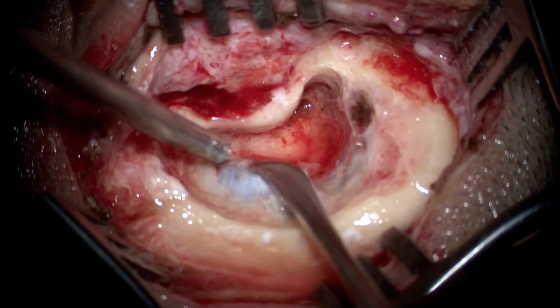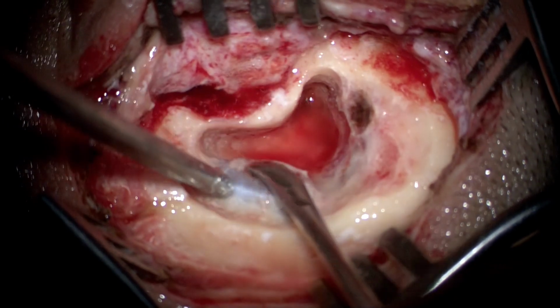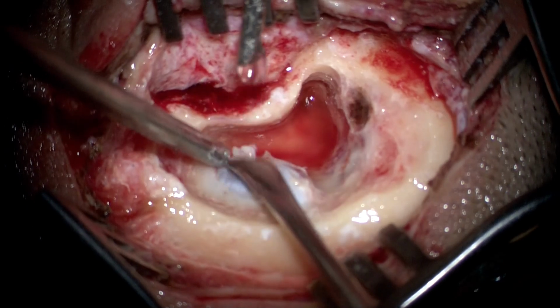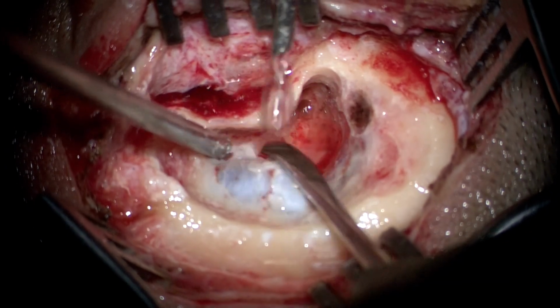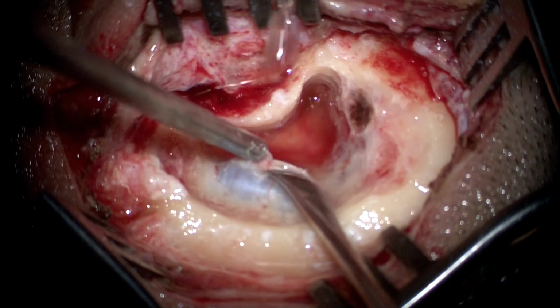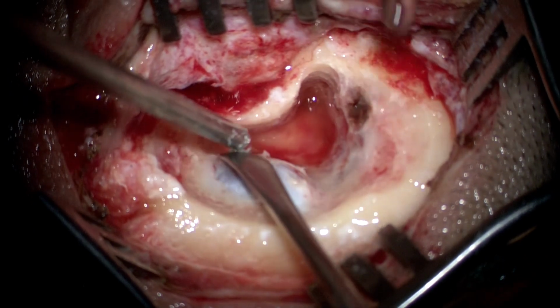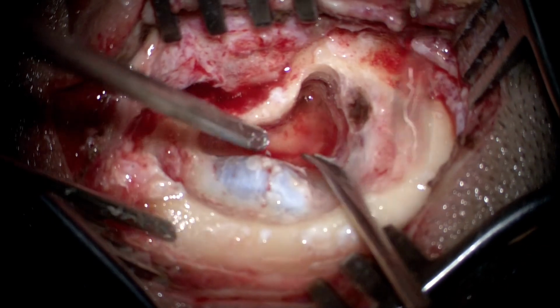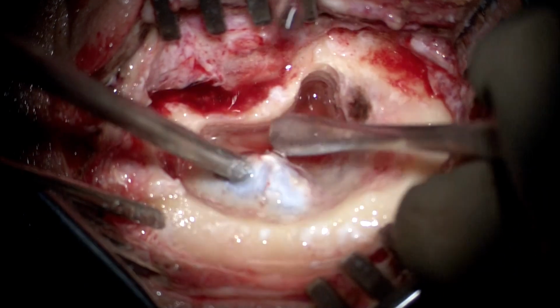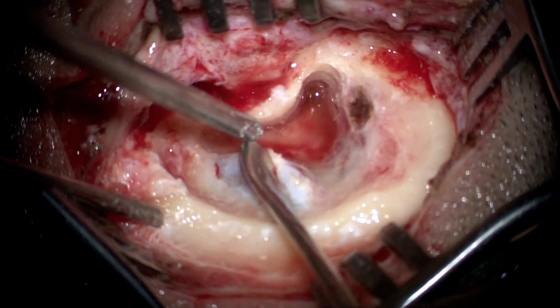So we can see now how the sigmoid sinus has been completely unroofed right now. It is just being unroofed, not really decompressed, but unroofing is the first step, and the amount of exposure we require till the levels of the posterior semicircular canals, that much length of the sigmoid sinus has to be unroofed. Once we have done that, we can see how much bone we may have to drill further by just gently pushing the sinus back using the same septal elevator.